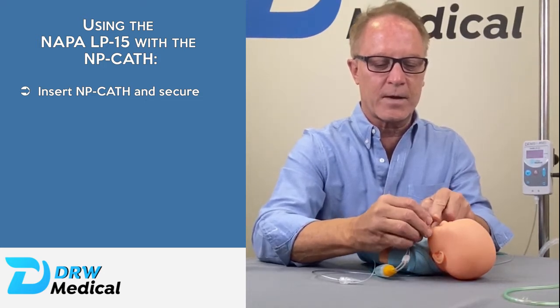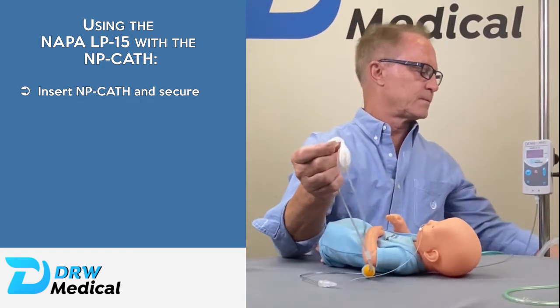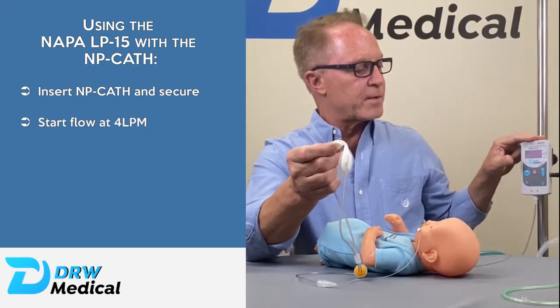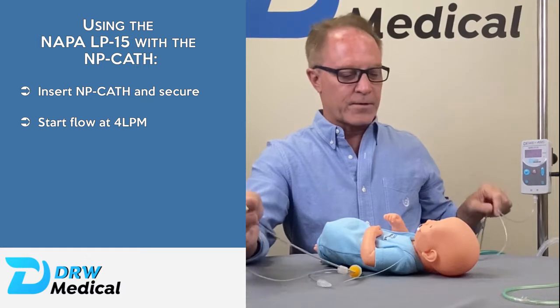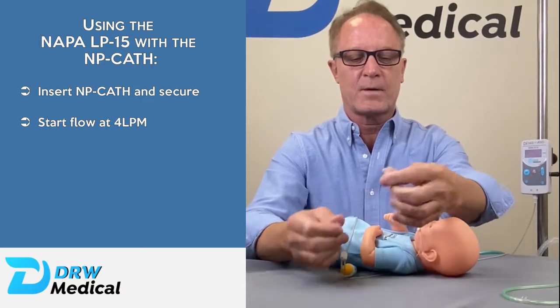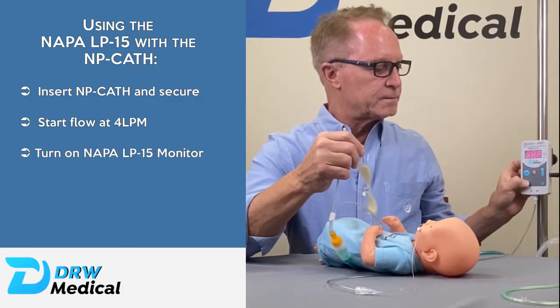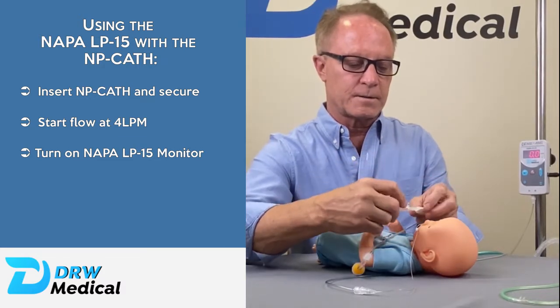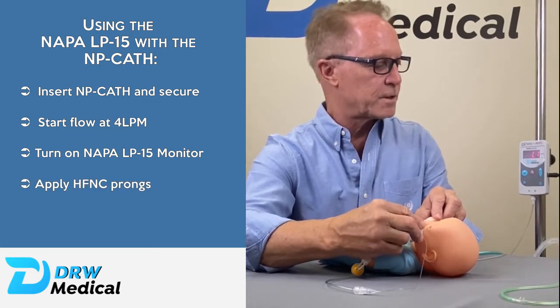We're going to secure that to the baby's face. We're going to turn our flow rate up to around four liters to start. We're also going to be using our NAPA LP15 monitor to measure the pressure. The NAPA LP15 monitor is connected by a sample line to the NP catheter — simple connection. We're going to turn that on, get a baseline of zero, and now we're going to adjust the nasal prongs into the baby's nares.